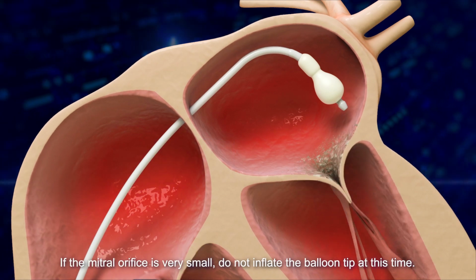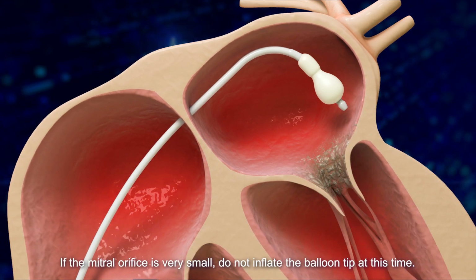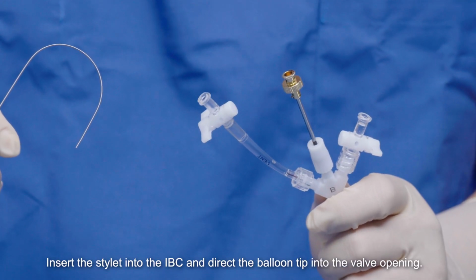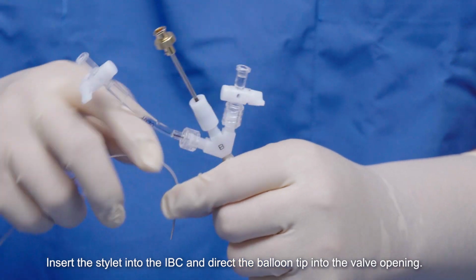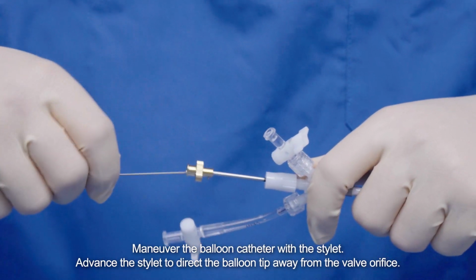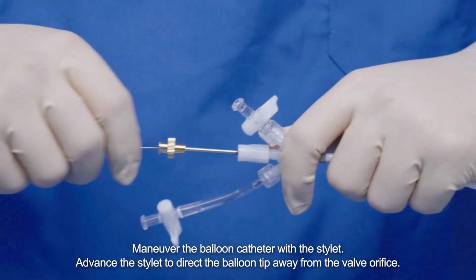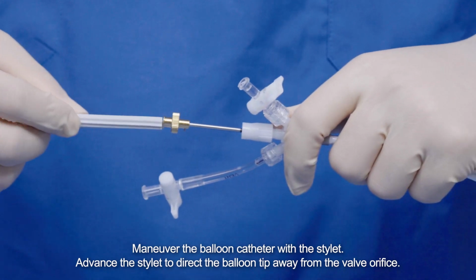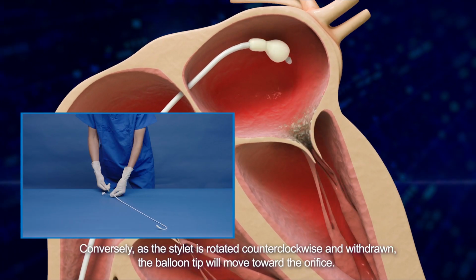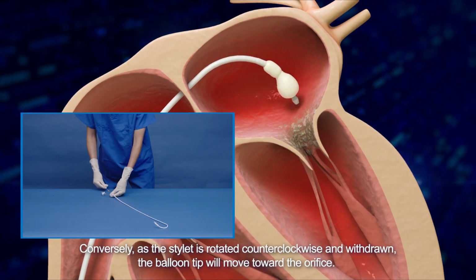If the mitral orifice is very small, do not inflate the balloon tip at this time. Insert the stylet into the IBC and direct the balloon tip into the valve opening. Maneuver the balloon catheter with the stylet. Advance the stylet to direct the balloon tip away from the valve orifice. Conversely, as the stylet is rotated counterclockwise and withdrawn, the balloon tip will move toward the orifice.